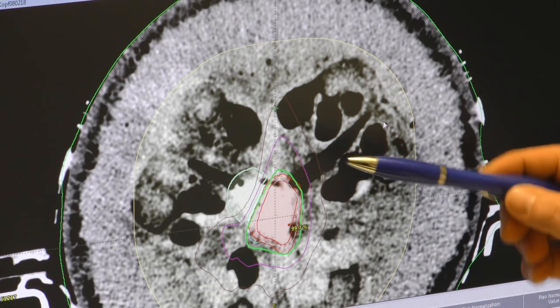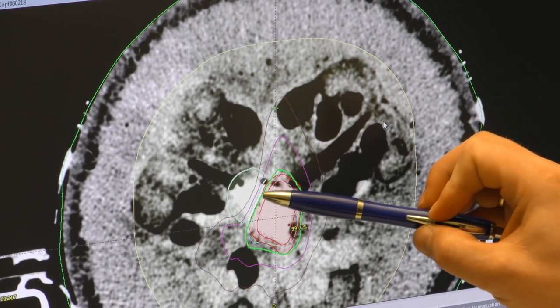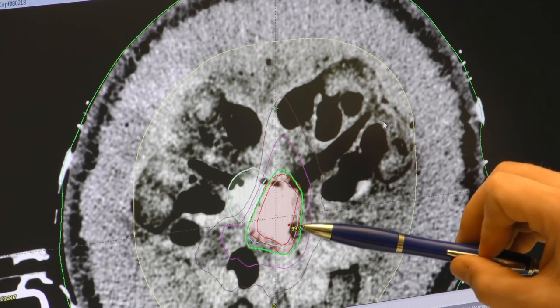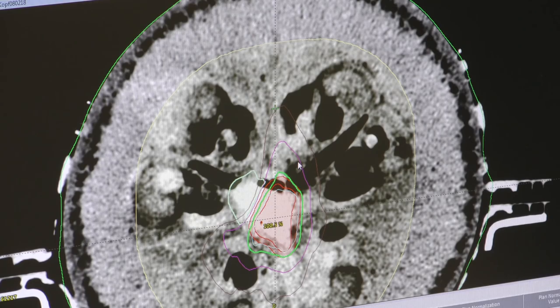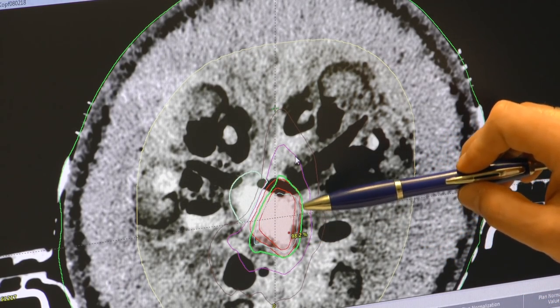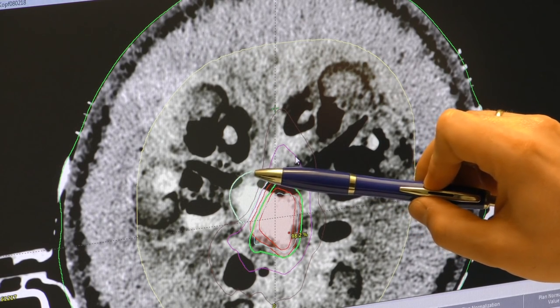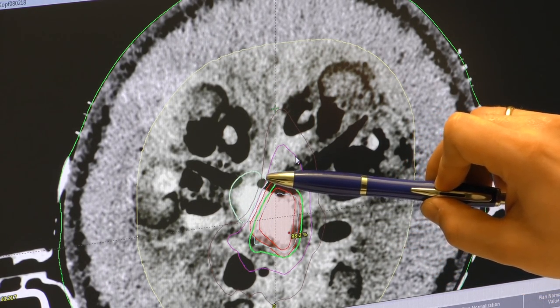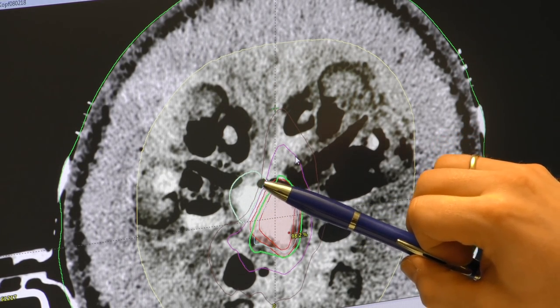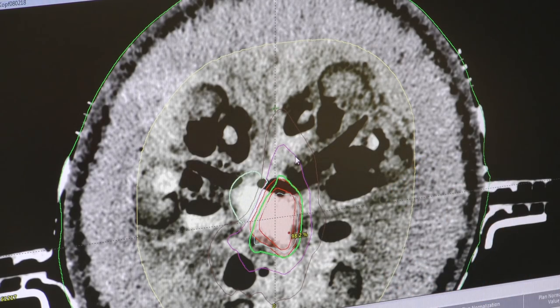We can see the dose distribution in each slice. Here in green is our dose with 80% of the maximum dose — this is our focus, our target area. At the other side, what we want to protect, we have a dose of only 20%. So we can protect that side of our liver.